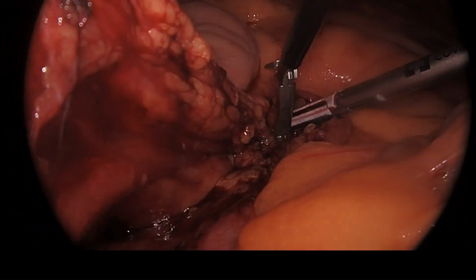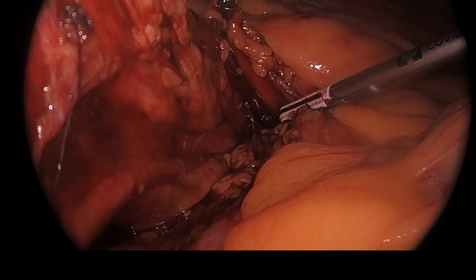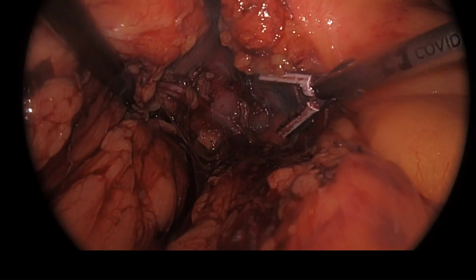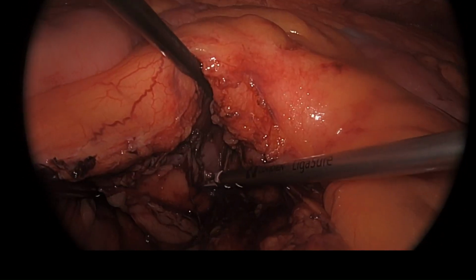You can see the right ureter on the screen. The right ovarian vein was coagulated from its entry into the vena cava, and the peritoneal dissection was extended to the level of the left renal vein. This vein can be seen marked on the screen.